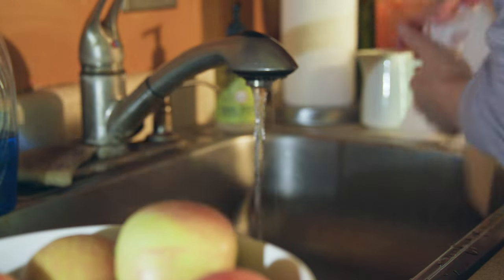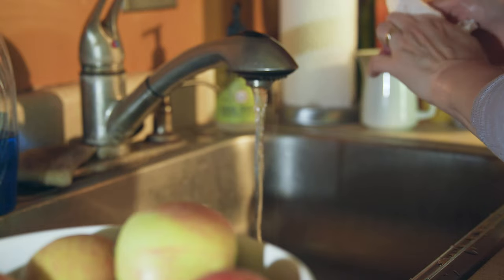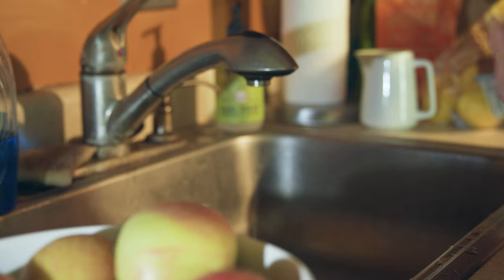Wash your hands thoroughly for at least 20 seconds and then dry your hands. Use a separate towel to turn the faucet off.